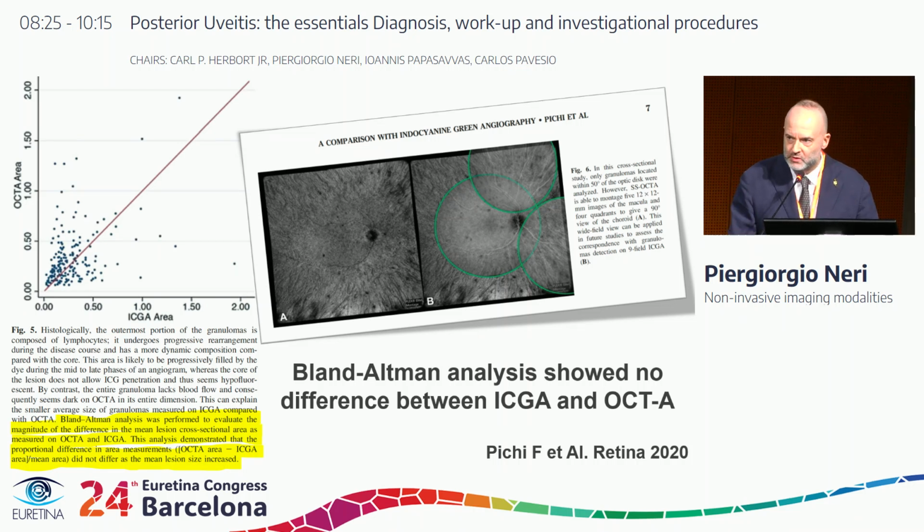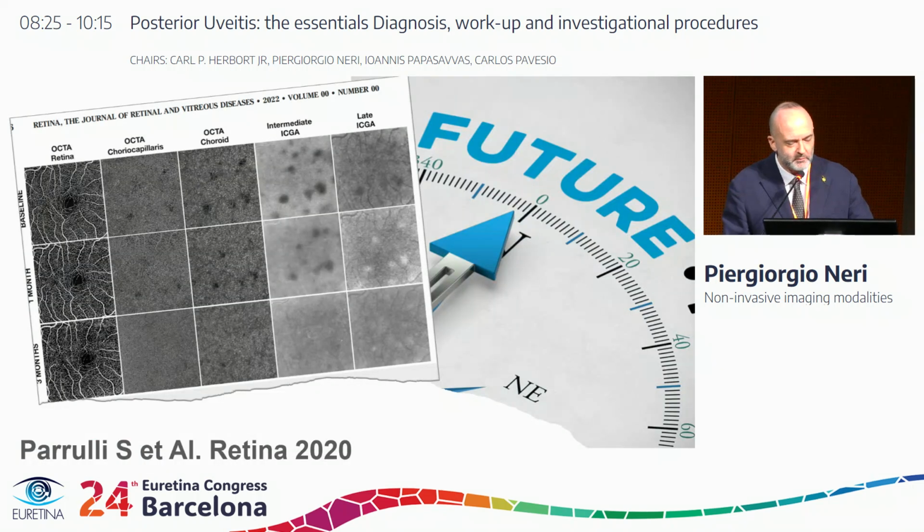I do agree that this is not available for everyone. Certainly it might be a perspective. For those who do not have the specific machine, don't try to do this with any other machine because they are not able to. There are others coming up in the market, but of course if you have ICGA and you don't have Plex Elite, certainly you cannot say that you can get rid of the ICGA.